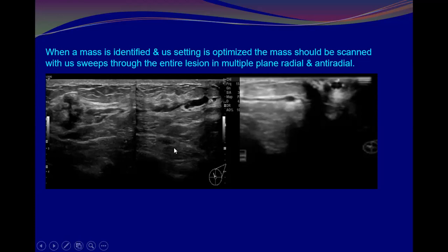No. Who said no? Muhammad? Yes. Why no? Excellent. Well done. Why? Split view, double images parallel to each other. Excellent. This is split. We call it what? It has a name. The technique we said last time, we have panoramic view. This is not panoramic. If it is panoramic, I can use it for measurement.